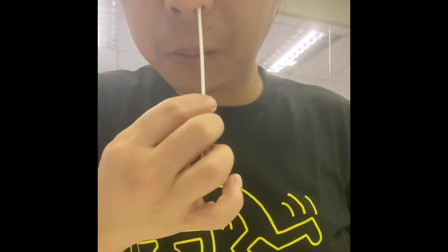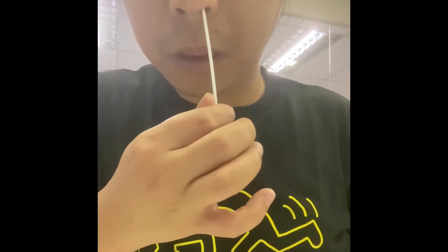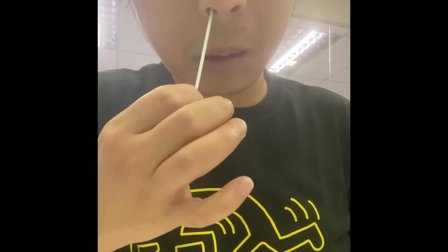Now I'm going to insert the swab sticks into the nose about 2 to 2.5 centimeters, and rotate the sticks about 4 to 5 times in each side.